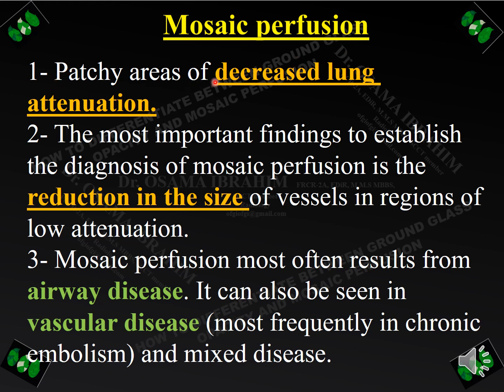Mosaic perfusion is a patchy area of decreased lung attenuation, meaning a black area. The most important finding to establish the diagnosis of mosaic perfusion is the reduction in size of vessels in the regions of low attenuation, as we will see in the next slides in practice. Mosaic perfusion most often results from airway disease; however, it can also be seen in vascular disease such as chronic embolism.